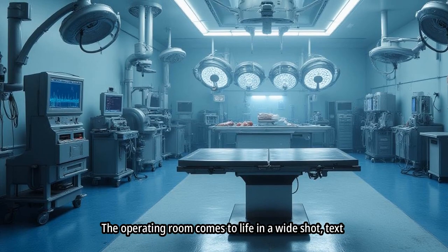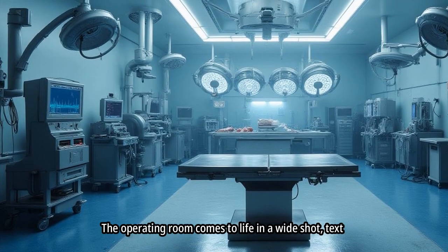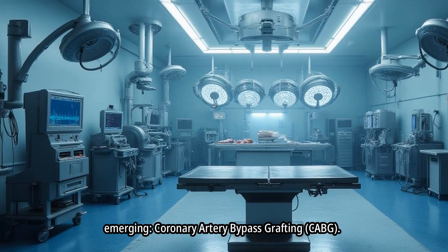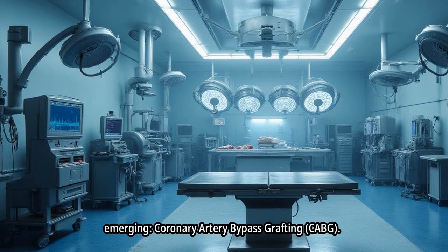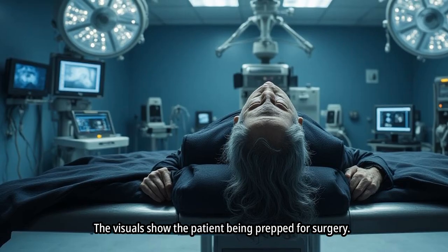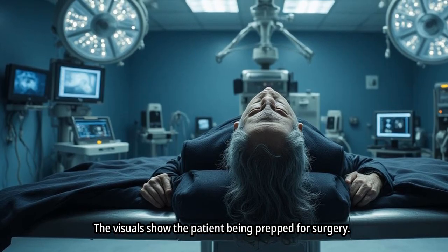The operating room comes to life in a wide shot. Text emerges: coronary artery bypass grafting, CABG. The visuals show the patient being prepped for surgery.